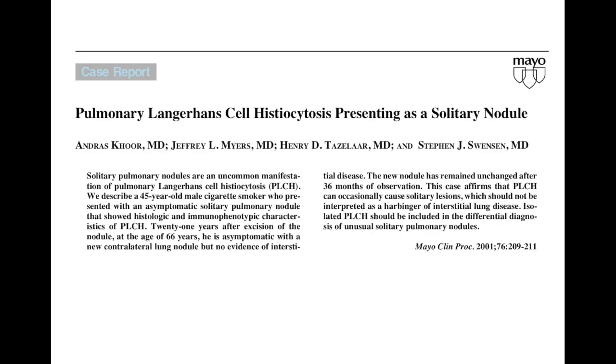I present this case report if you want to read it: Pulmonary Langerhans cell histiocytosis presenting as a solitary nodule, by these authors. Dr. Henry Tazelaar is from Mayo Clinic, Scottsdale, and this is a real case of a solitary pulmonary nodule of Langerhans cell histiocytosis.